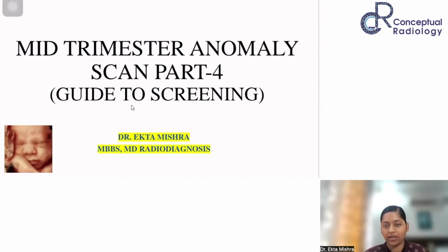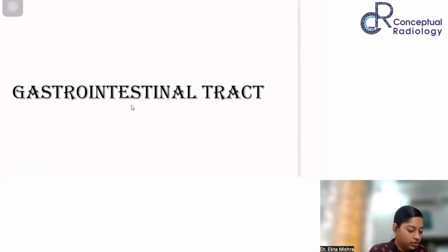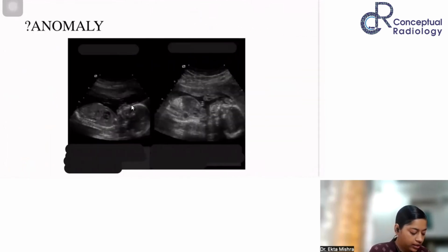We are back on our mid-trimester anomaly scan part 4. So today we'll be starting with GI anomalies. It will be an interactive session. It's a little dry topic because we'll be dealing with skeletal abnormalities also. So be interactive and give answers.